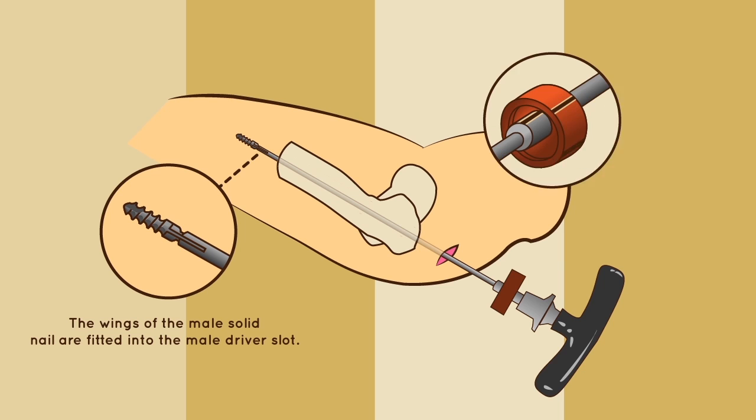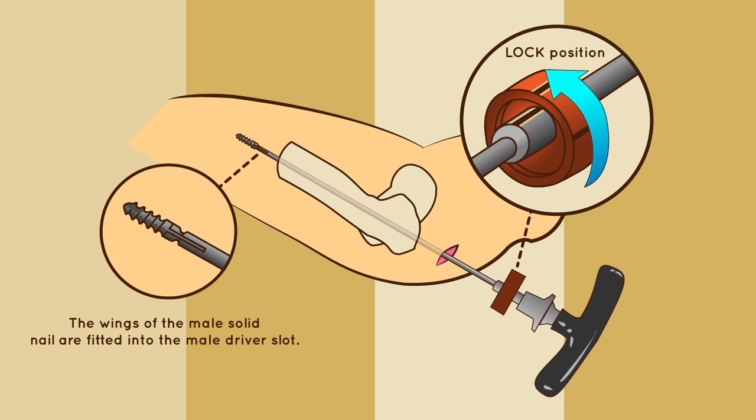To lock the male implant, simply rotate the eccentric ring to the lock position.